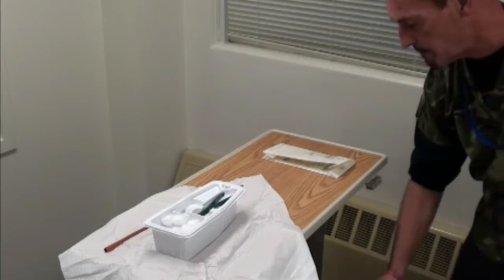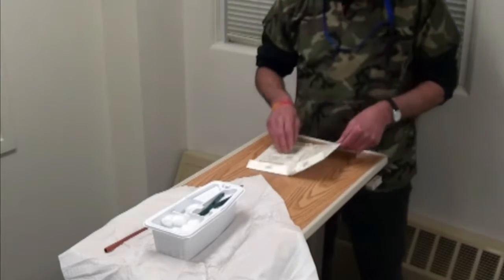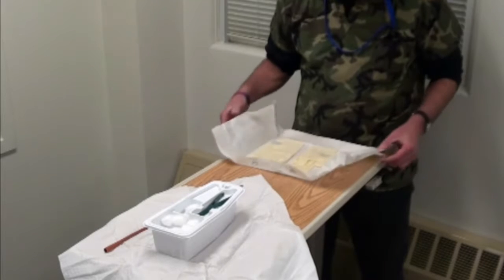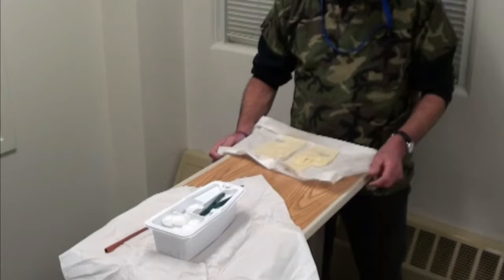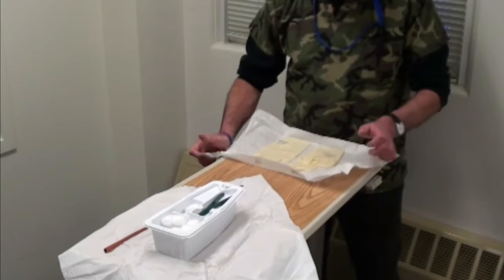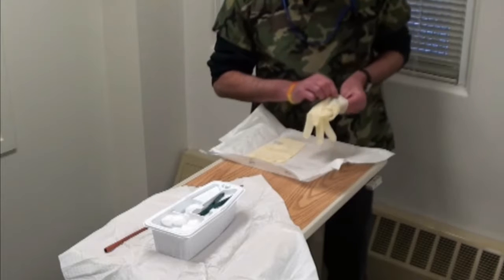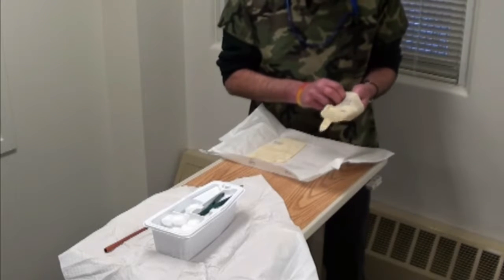And so I don't contaminate my field, I'm going to actually step around, open the package up, touching only the folded part. I'm going to put on my left-hand glove first.